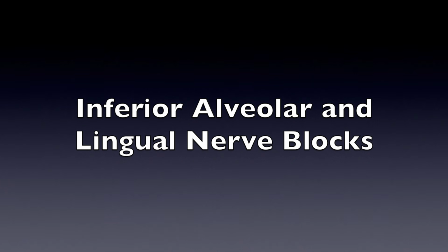For the faculty, let them know when you have reached your landmark. Also, verbalize when you are aspirating and the results of the aspiration twice. Also, let them know when you are prepared to deposit solution. Keep in mind that the aspirations will occur for both the IA and the lingual.